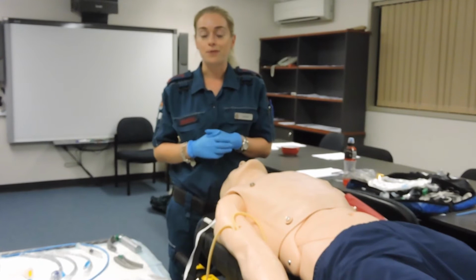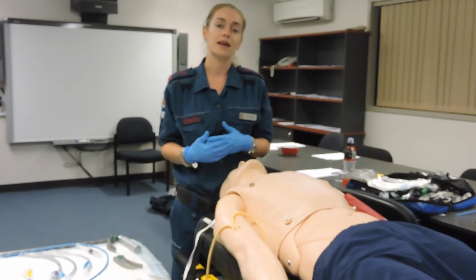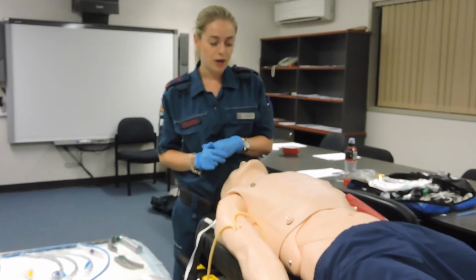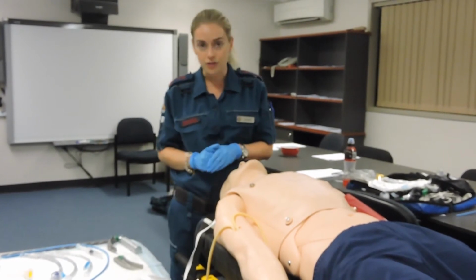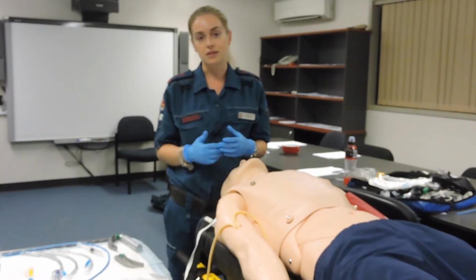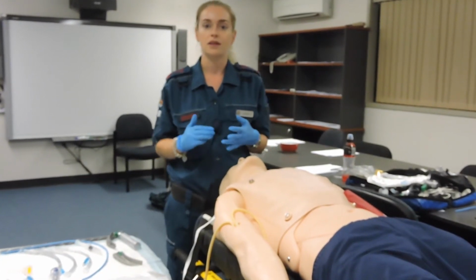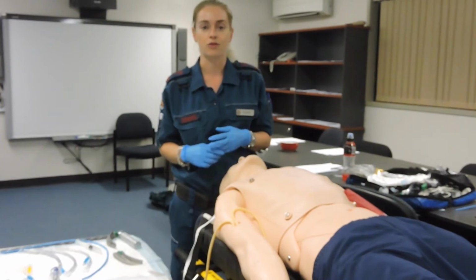If the LMA happens to fail, that is our indication to then go for a surgical airway. Surgical airway is a skill that is not done frequently pre-hospitally, but when you need to do it, it must be fast-paced, and you must have gone through your failed intubation algorithm and be aware of what you need to do.